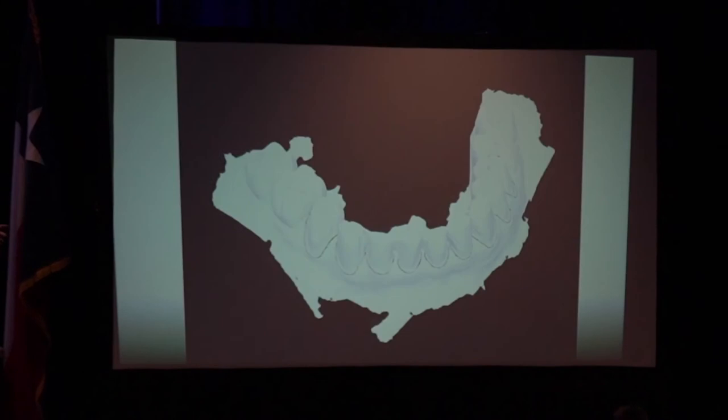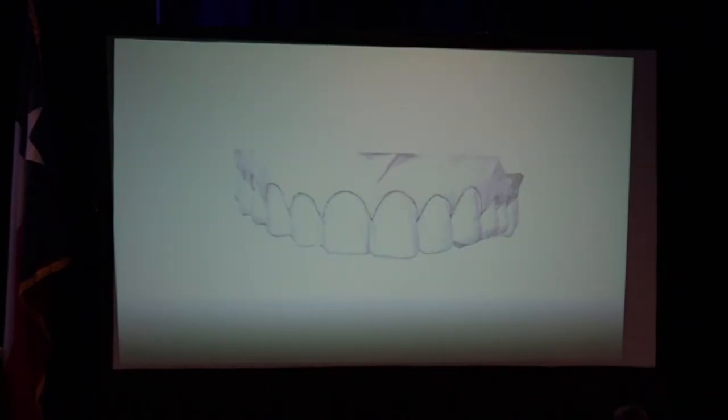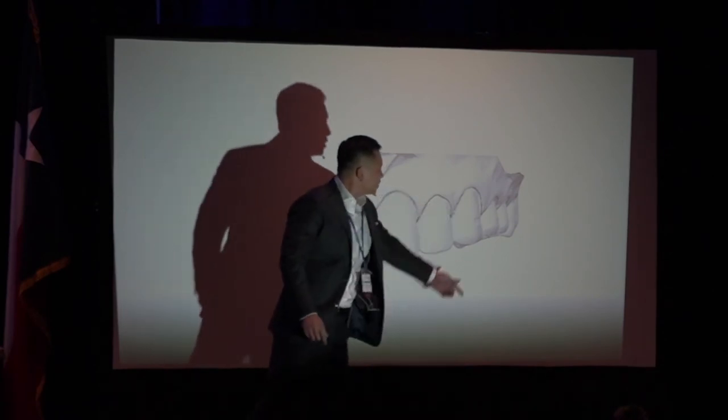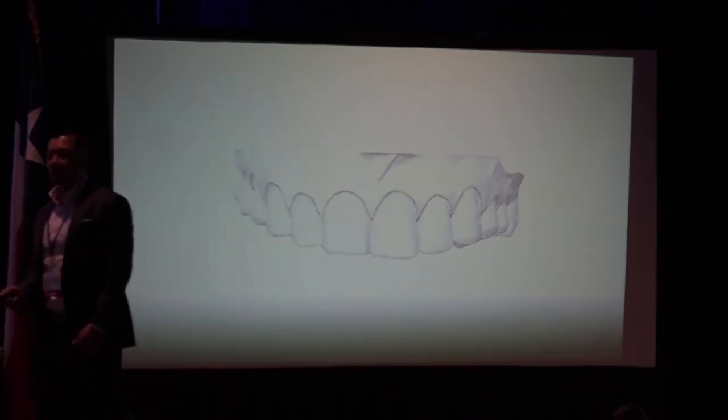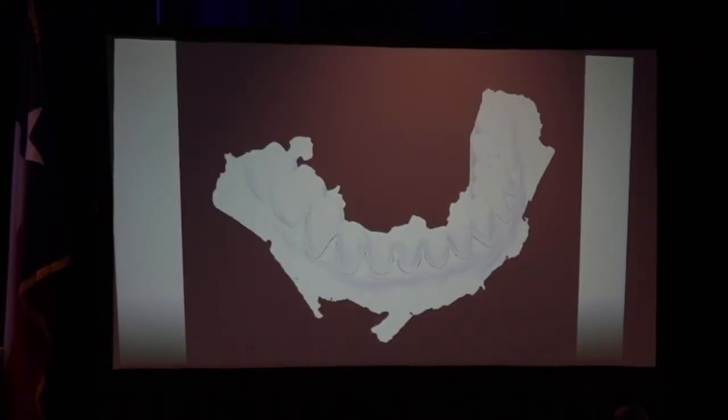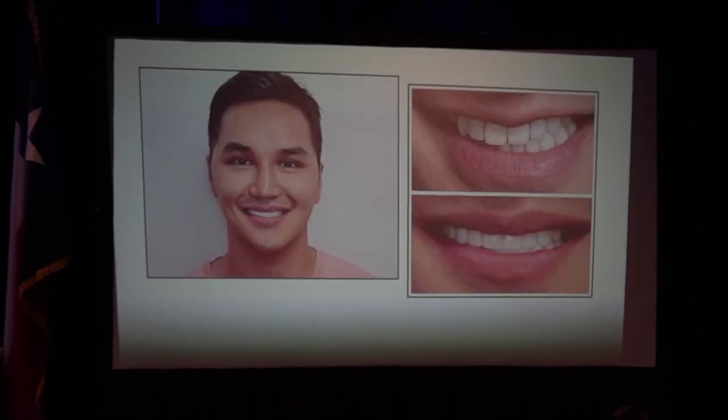That's what you're seeing. You can't see it on this projector there. Just have a pointer. I went a little bit too deep there because that's where you're seeing the depth cuts there. So I took it out a little bit, smoothed it out. But I'm transferring the additive wax up to his teeth, prep through that, take it off, pack the cord, took an impression, and then we took the ideal wax up and transferred it into the mouth. And then that's what we ended up with.